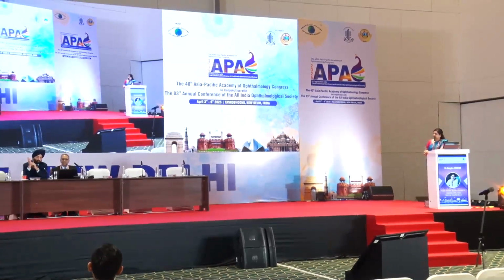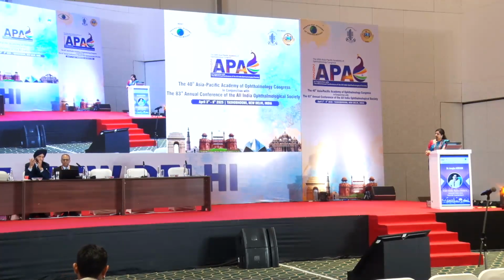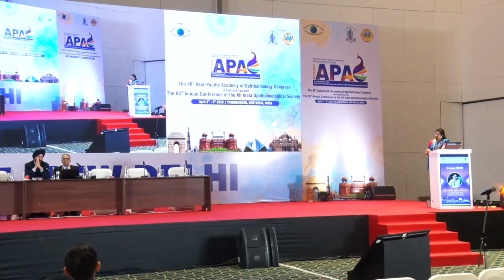So broadly, whenever you're looking at a refractive surgery that has been done for myopia, specifically RK, you never hit the target. You do the TrueK and you do that, but I always overcorrect a little bit more, and depending on the number of incisions or how flat the cornea is, that overcorrection from my side could go up to an addition of 1 in the power to about 3.5 in the power. But one thing I always tell the patient, I take it on the consent form, that residual refractive error can be the thing that will be left.